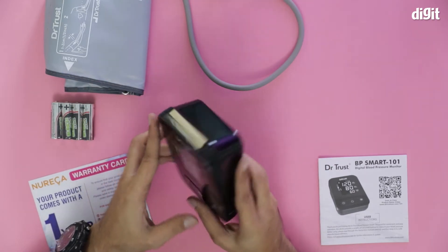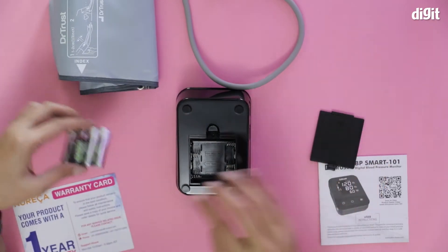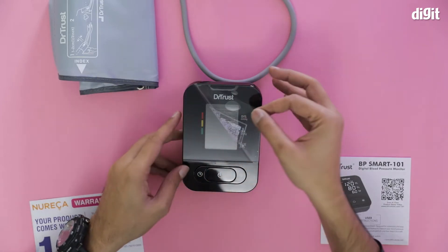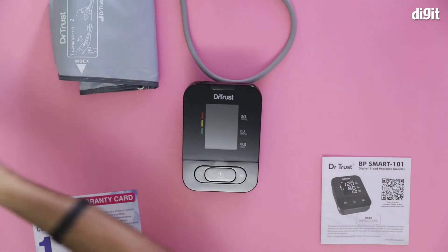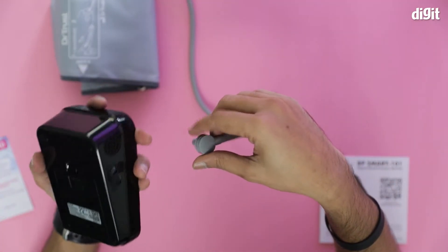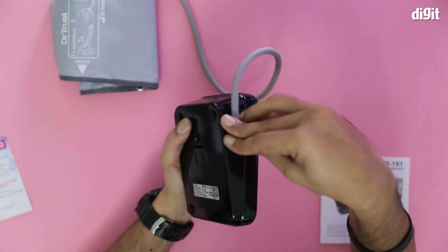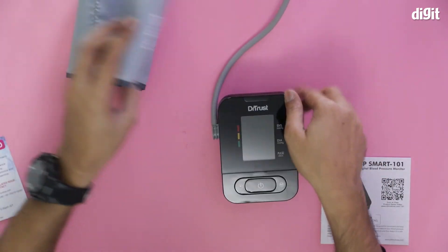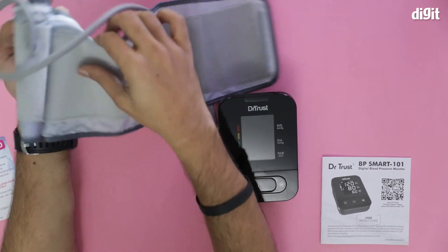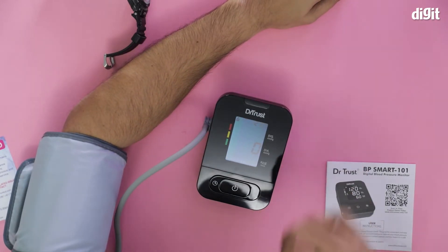I'll show you some aspects of that in a while. This is where the batteries go in — I'm going to put them in. I'm going to remove the sticker first. Let's attach this — yeah, this is where the tube goes in. And I'm going to attach this here. Since it starts automatically, I'm going to wear the cuff and measure my blood pressure. Dr. Trust's BP monitor is ready for use.